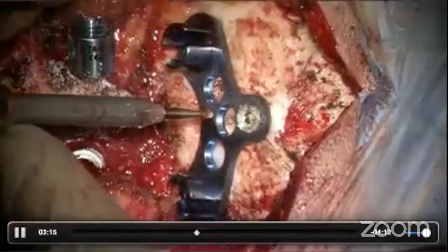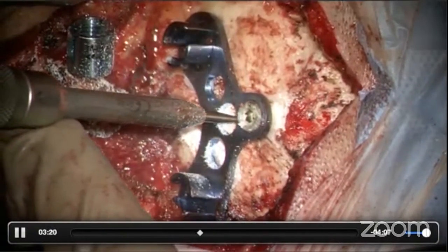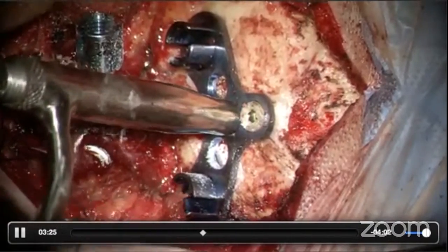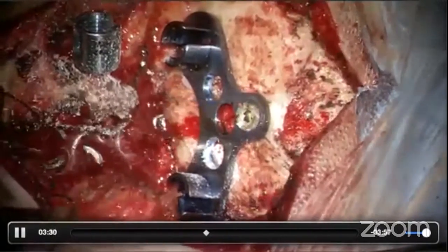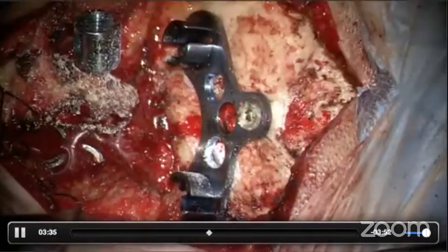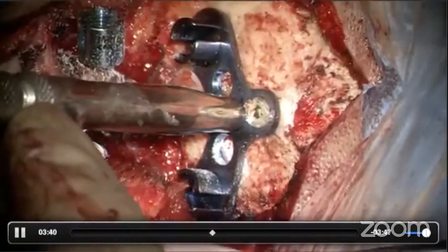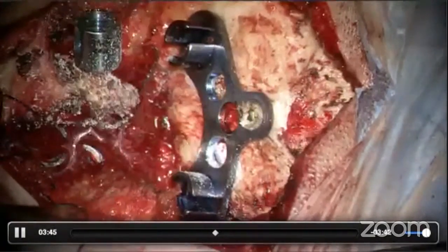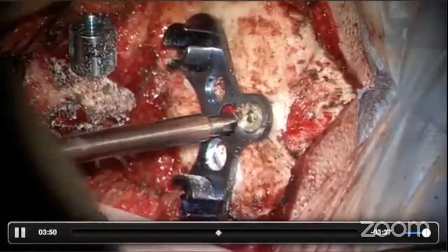Similar steps are carried out for the other screw holes. As you move caudally from the EOP, the thickness of the midline keel will gradually reduce. The screws off the midline on either side have the thinnest skull thickness in this configuration. Approximately the midline screws are somewhere between 10 and 12 mm, and on the sides they are about 8 or 6 mm. If we have used a 12 mm screw at the top, this one is either going to be a 10 or a 12. Again, ensure that the screw holes are tapped completely to the inner table.